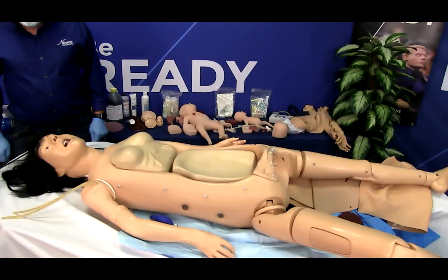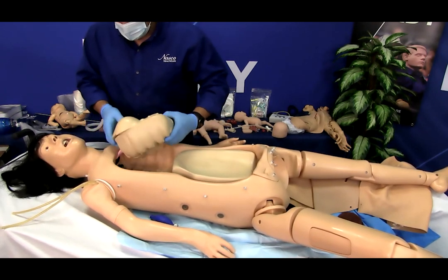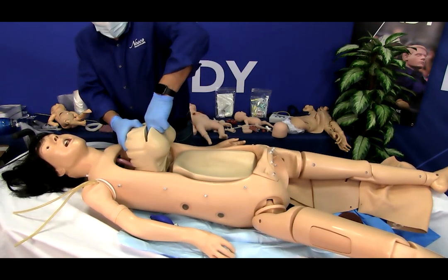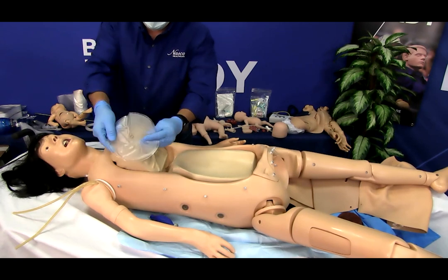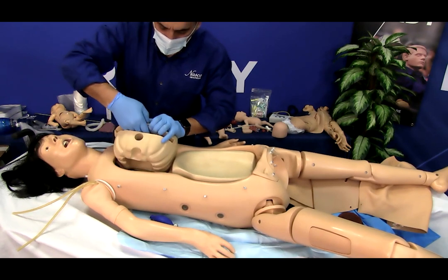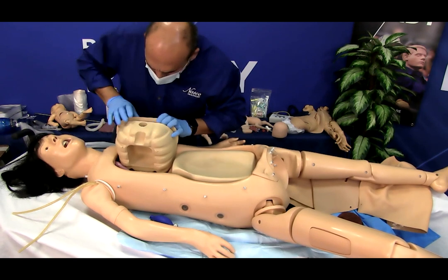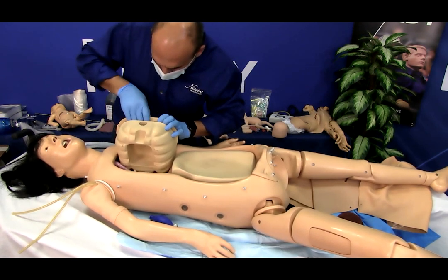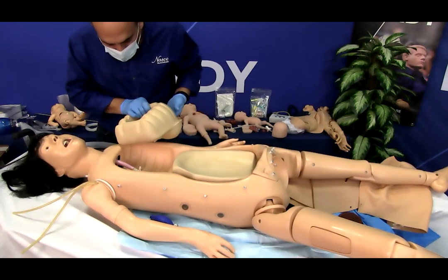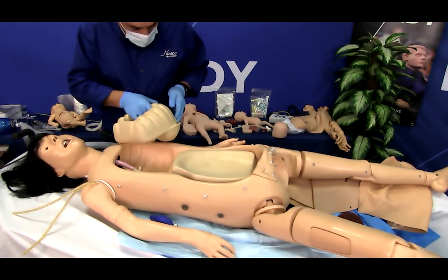For your chest and lung bag, connect to the trachea tubing with the elbow connector extending into the torso from the attached head. To connect the airway and install the foam CPR chest, slide the lung bag in the pocket of the foam CPR chest. Position the lung bag inside the chest so that the port on the lung bag aligns with the hole inside the chest. The port fits through the foam CPR chest to the back.